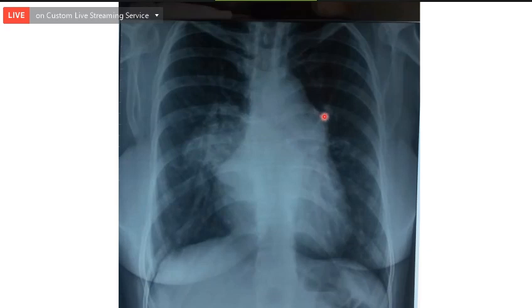And what is this? Pulmonary artery segment, which is prominent. Yes. So two structures are prominent here. Aorta is prominent, pulmonary artery segment is prominent. Okay, what else? Near the pulmonary artery, there is calcification also seen. What is this? Possibly, sir, PDA. Yes, it's a PDA calcification, because you can see two calcifications, a parallel calcification. That is a classical feature of PDA calcification. You can see that it is traveling from the pulmonary segment towards the aorta. So this is a calcified vessel, and that is the PDA.